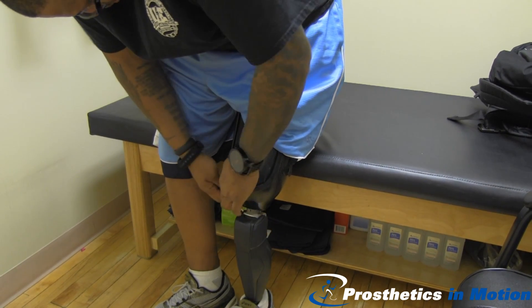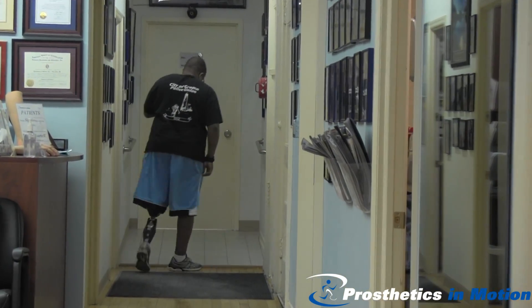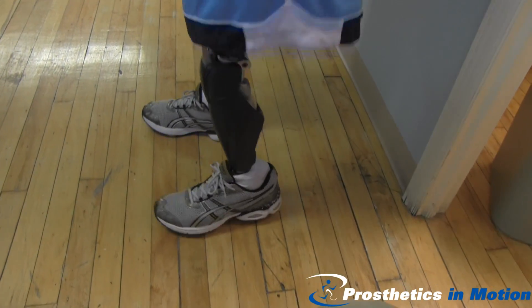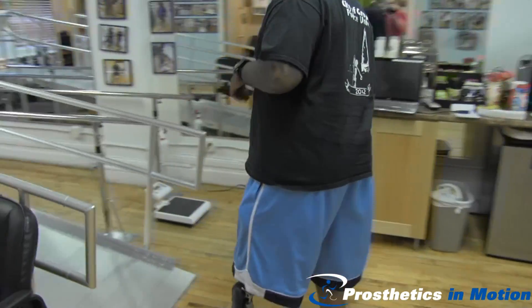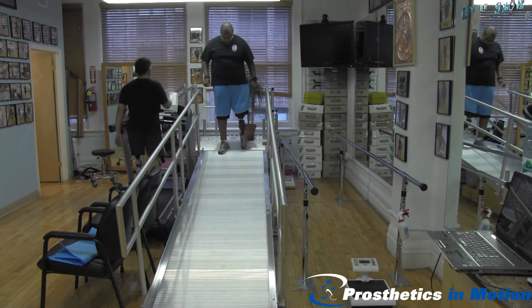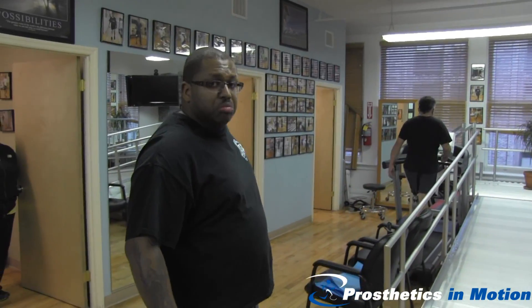Now we're going to watch him walk outside. Let's go up the ramp and down the ramp. How does that feel? Yeah, it's actually the first time I've done it without using the rail. Just go one time with the rail.